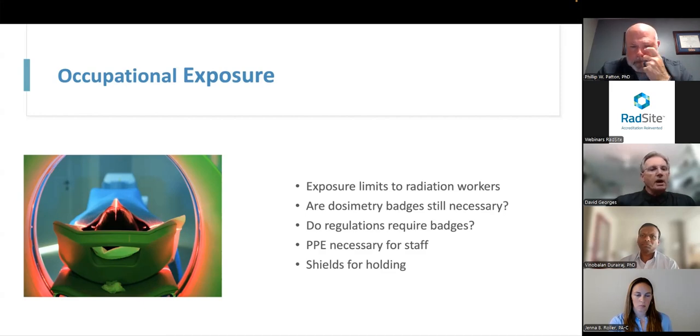So if we try to replicate what we've learned over the years with mammography machines, it's set up very similar. The patient is on a table and the operator goes behind the lead glass protective barrier to make the exposure, although the exposure in this case is very, very low, but I think safety is paramount, and this is just a great way to configure our systems as we prep for delivery and installation.